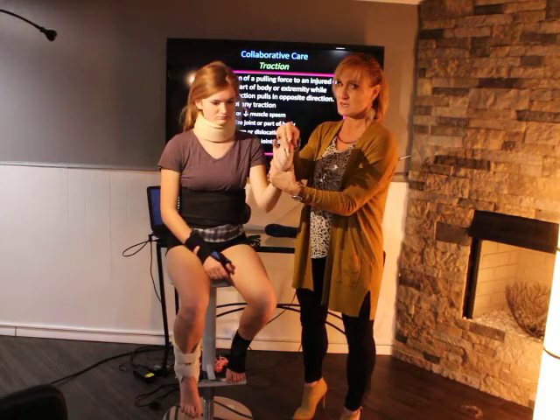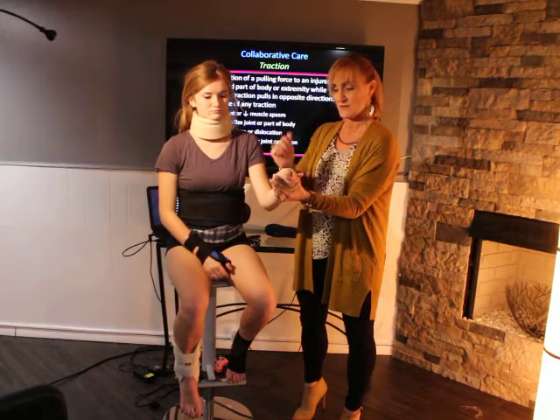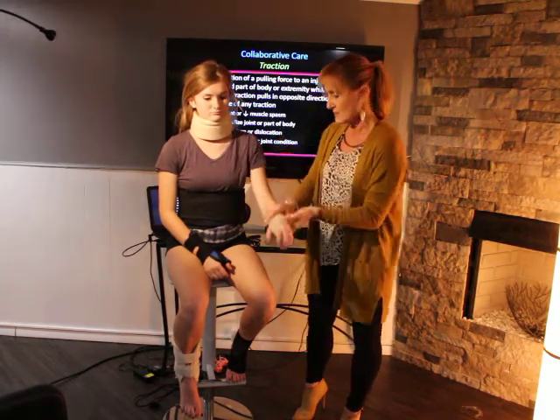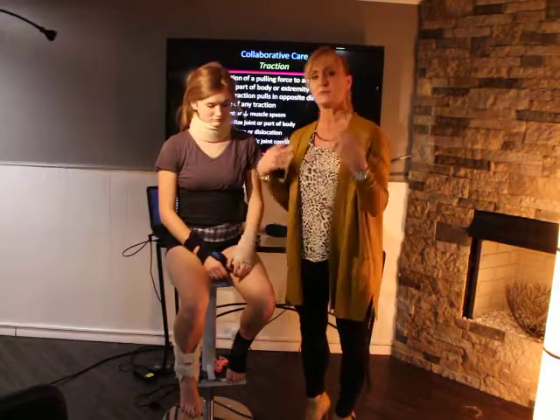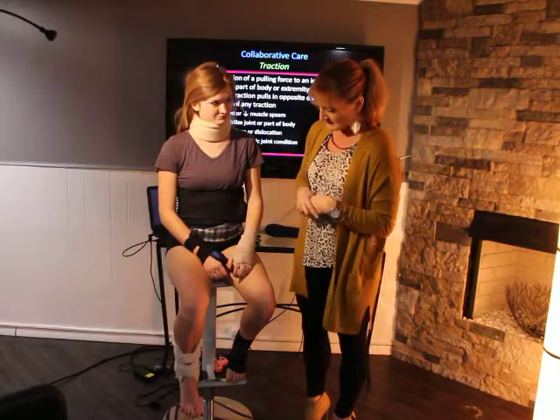Those fingers should not be getting blue. They should stay warm, but there should be enough compression on there to keep that inflammation down. So, okay, that is how you apply braces, splints, and ACE wraps.